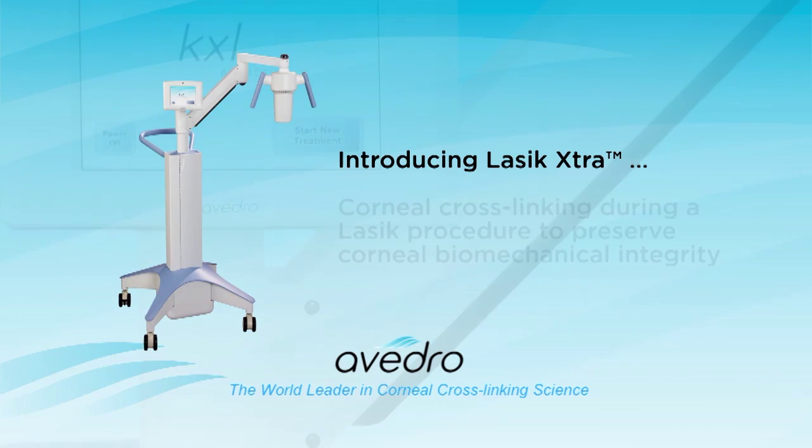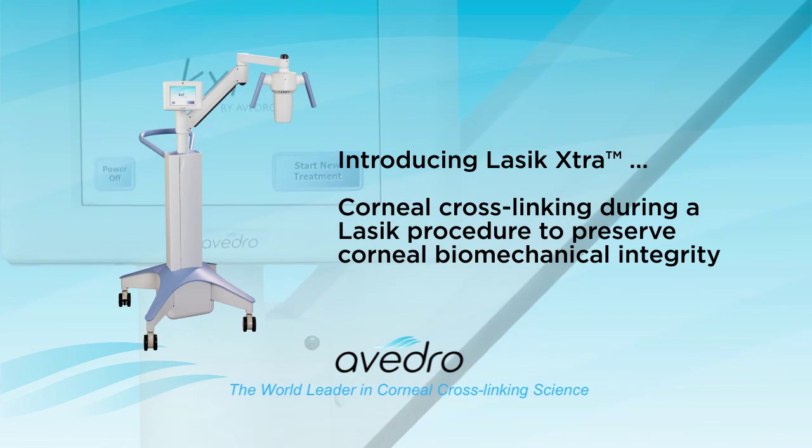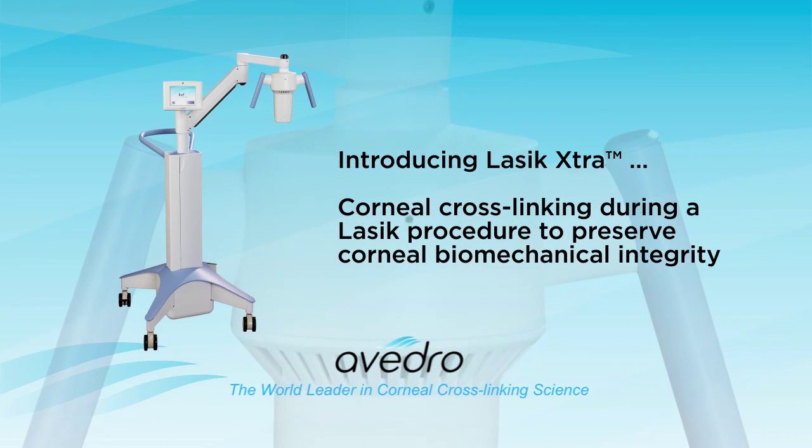Introducing LASIK Extra — corneal cross-linking during a LASIK procedure to preserve the corneal biomechanical integrity.